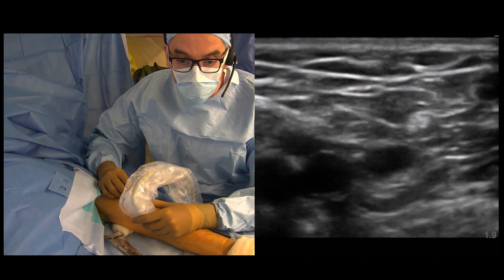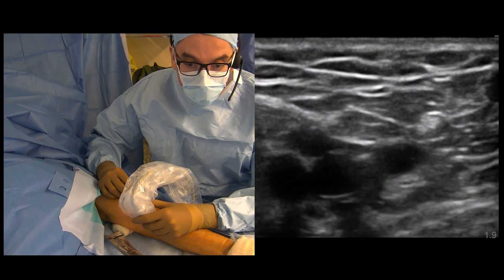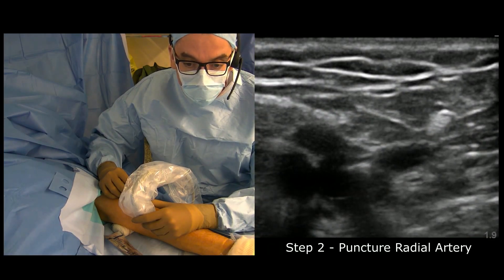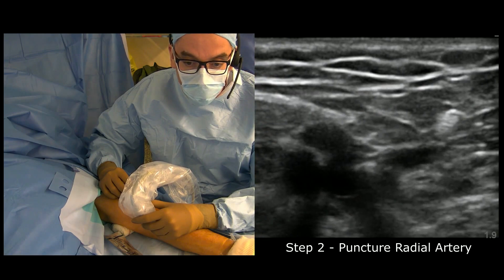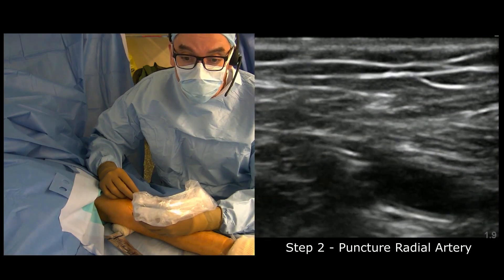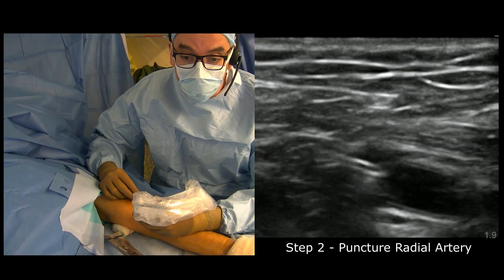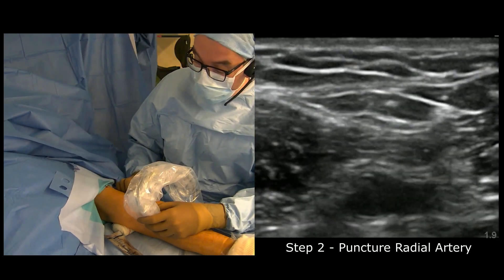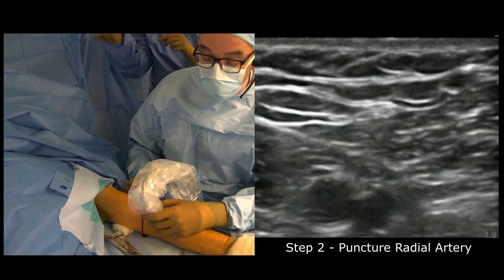With this technique, very fast and easy, I will reach just in front of the radial artery and start pushing against it. I can see that I'm almost ready to enter. I'm going to switch to longitudinal view and push to enter the radial artery. I have pulsatile flow right here — you can appreciate the pulsatile flow.